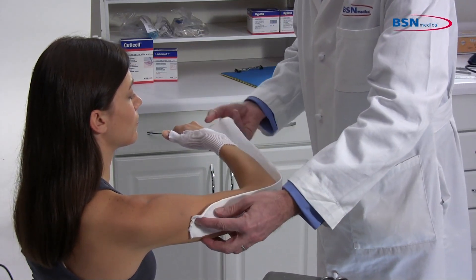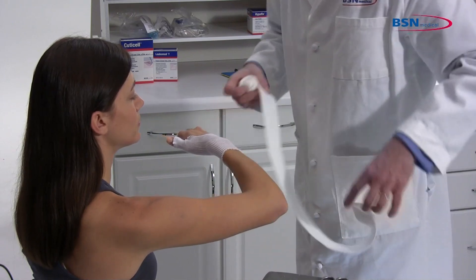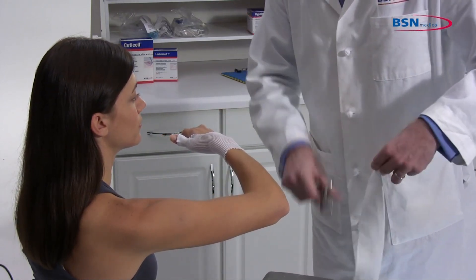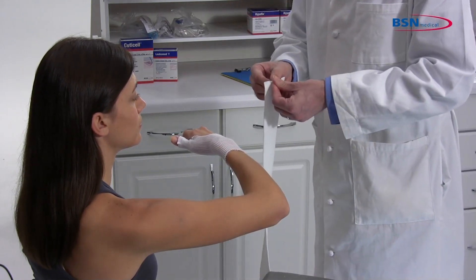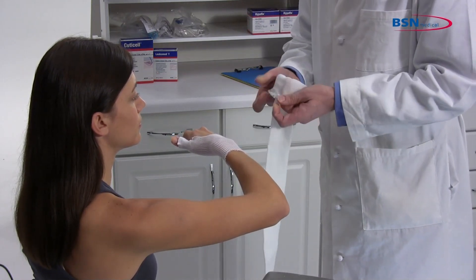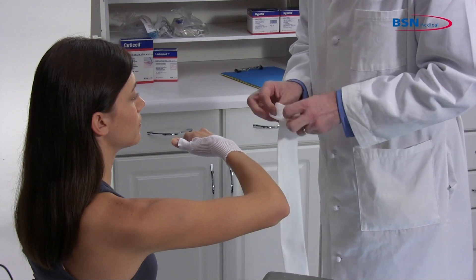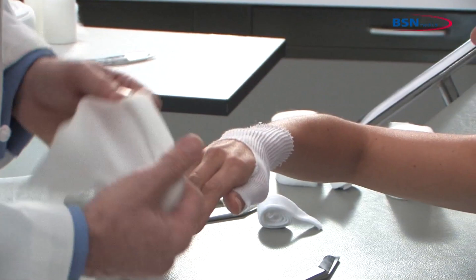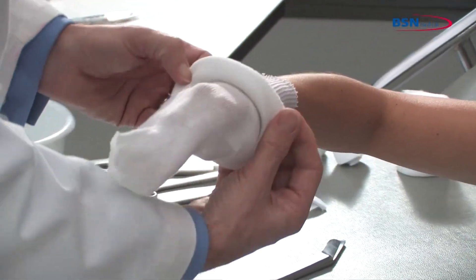Select a stockinette that will not be restrictive at the widest part of the limb. Make sure you use enough stockinette to allow foldbacks at distal and proximal ends. Now roll up the stockinette before applying to the limb to lessen pressure while applying. Roll on the thumb and remove all wrinkles and creases.